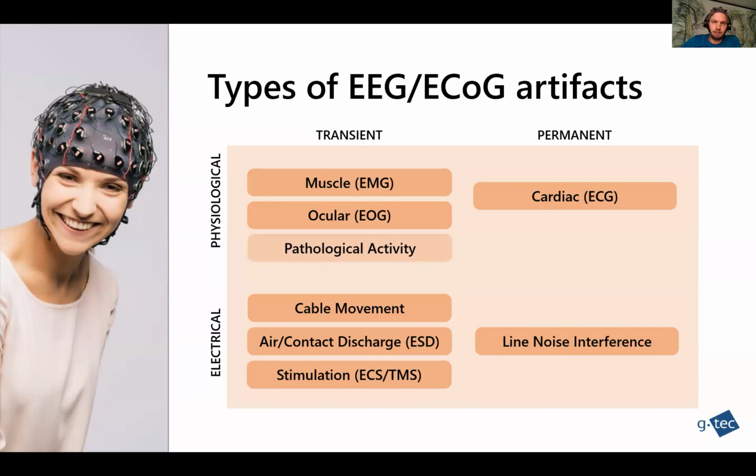What can also happen, and it's really a question whether it's an artifact or not, is pathological activity. It's very difficult to distinguish or classify this because pathological activity, for example epileptiform spikes, basically spiking activity from epilepsy patients, can have very large amplitudes. So this really leaves the range of a typical EEG recording and would be, for example, classified as an artifact if you're going for amplitude deviations or something like this. And it also has a different spectral characteristic than EEG. So if you're going to do some artifact removal, most likely you will end up removing pathological activity as well.